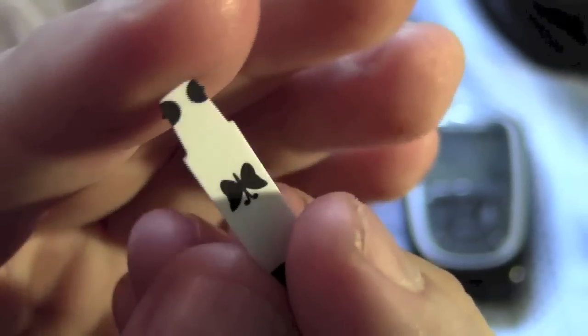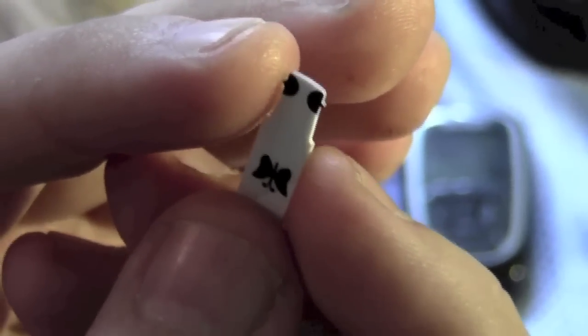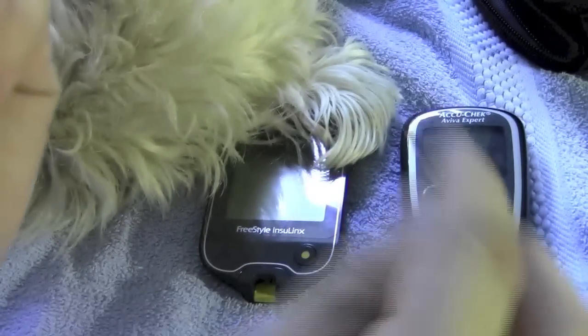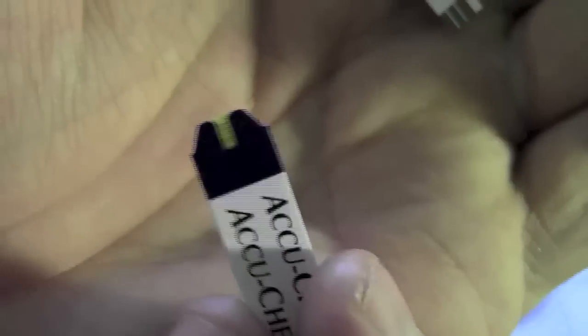One advantage I've found with the Freestyle Light test strips is that if you don't get enough blood on it the first time round, you've got 60 seconds to squeeze a little bit more blood out and apply some more. Whereas with the AccuCheck ones, you have to have the right amount of blood first time round.